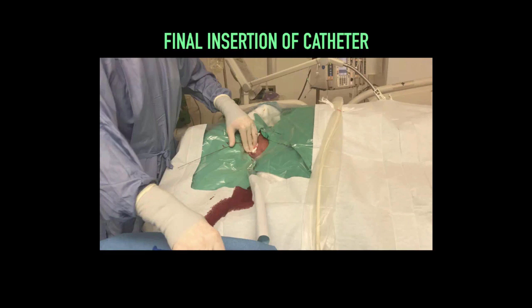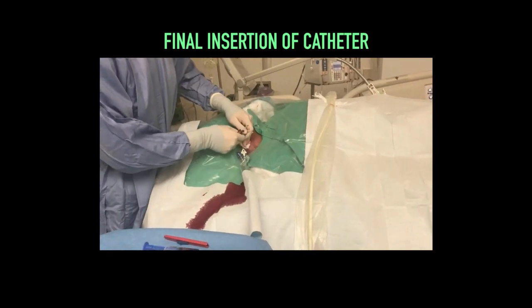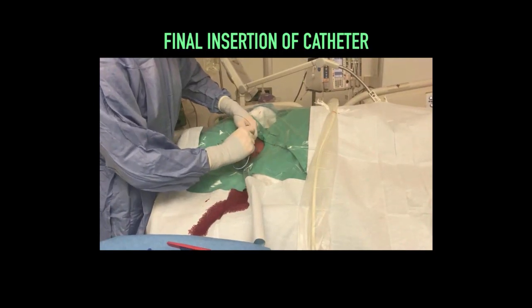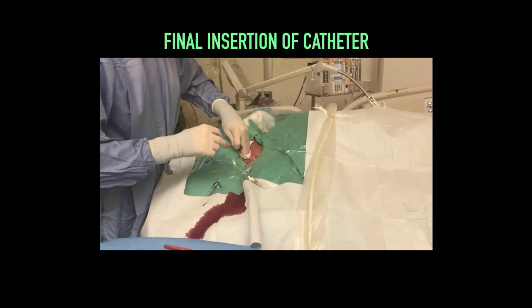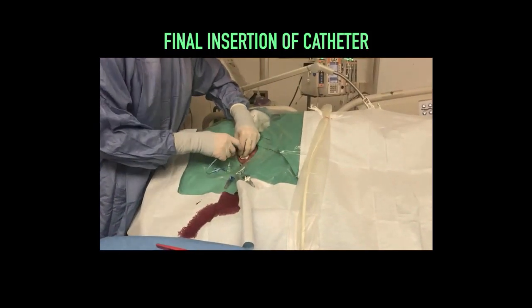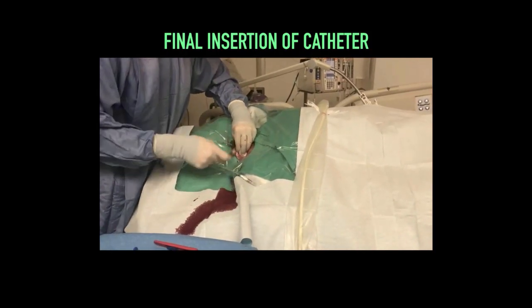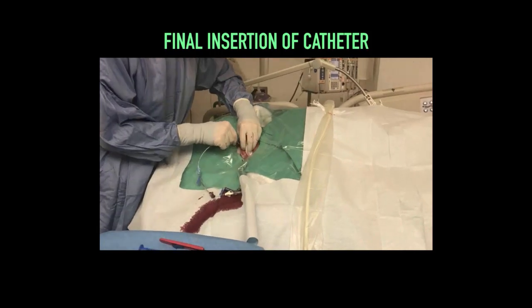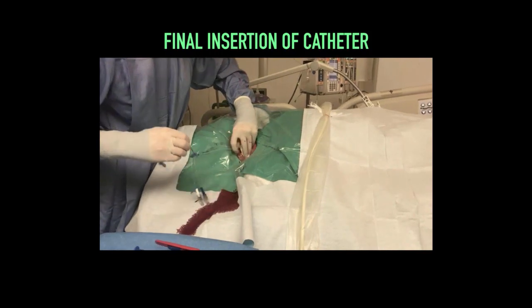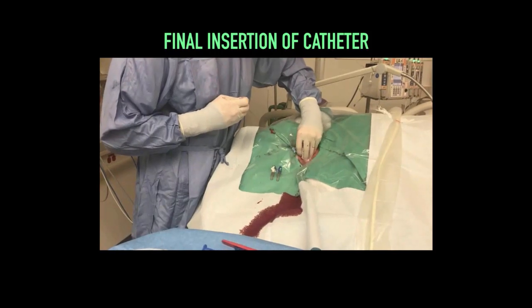Next, we will insert the triple lumen catheter. As the catheter is inserted over the wire, you will see the wire appear from one of the ports. In this case, it is the brown distal port. If you are uncertain, you can easily check this when setting up prior to catheter insertion. Notice the wire is held at all times and is fed through the catheter until it appears from that port. This is to make sure that the wire is not lost during the procedure. Once the wire is seen, it can then be held with the hand fixed and the catheter inserted over the wire.